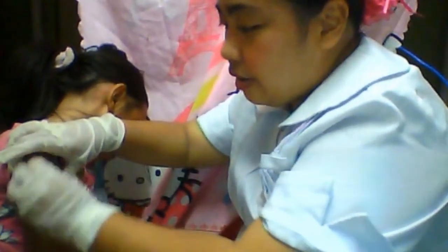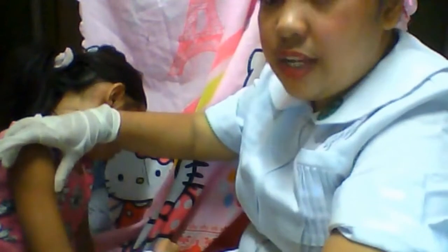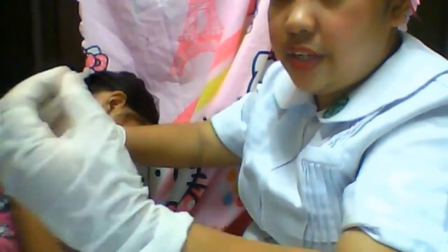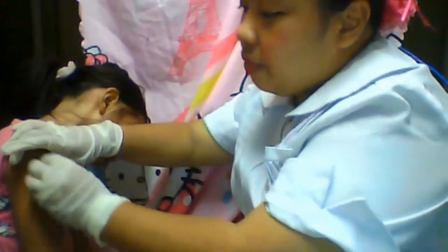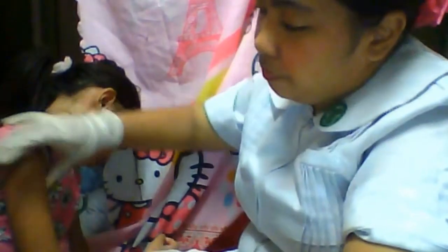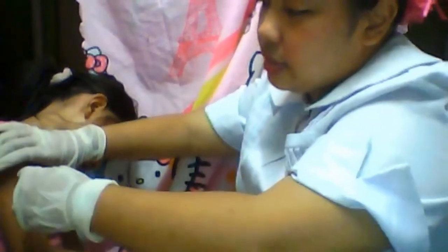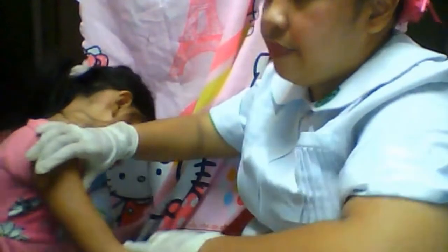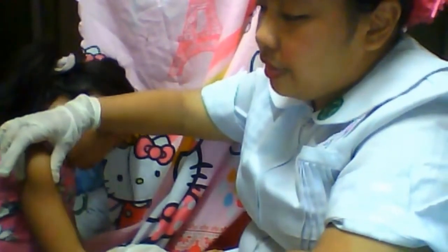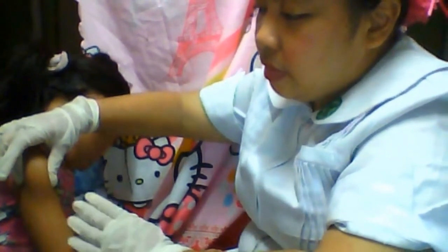So 1, there you go. If you need to clean again, discard your cotton ball and get another one and then wipe. There you go. So this is your area here, and then you pinch this one, because we want to hit the muscular area.